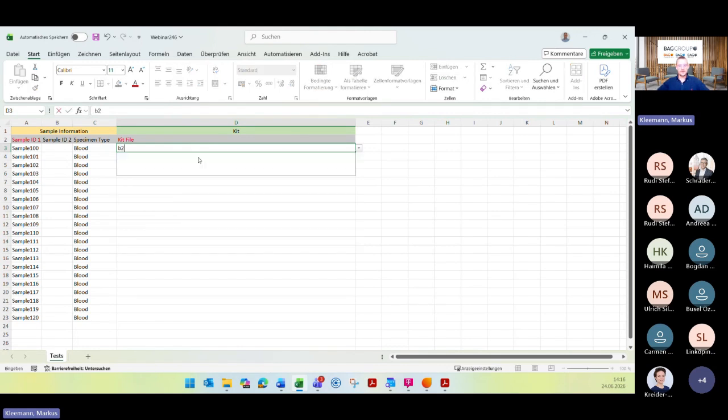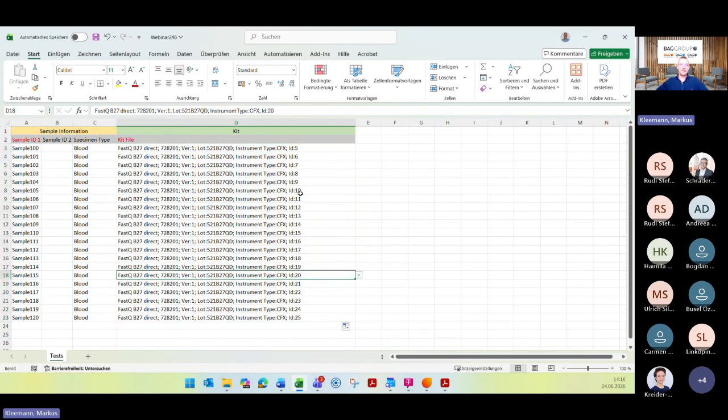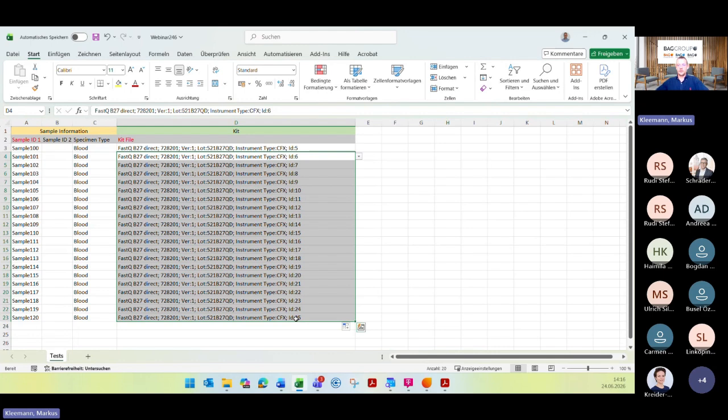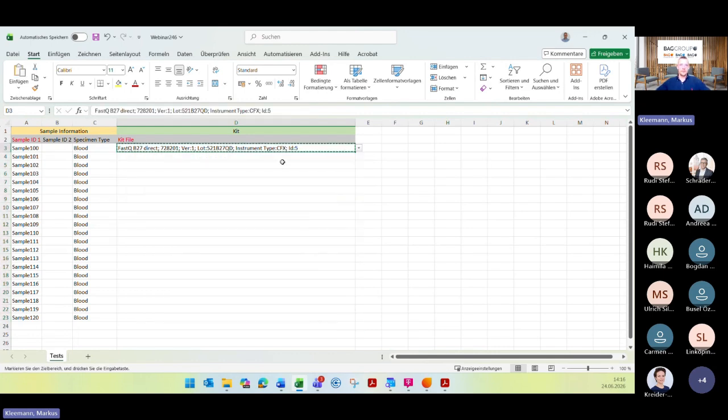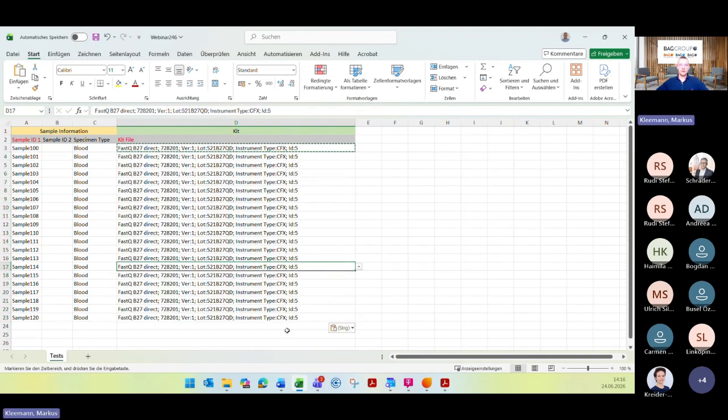You can do it like a text search, and I will use this kit file here. But just be careful when you do this for all the samples. Do not drag this kit file down like this, because otherwise you can see that the ID here moves, and this is then not the correct kit file anymore. So I just copy this one, mark this whole field here, and then you can fill in this whole table.